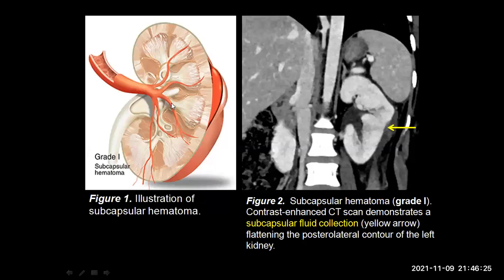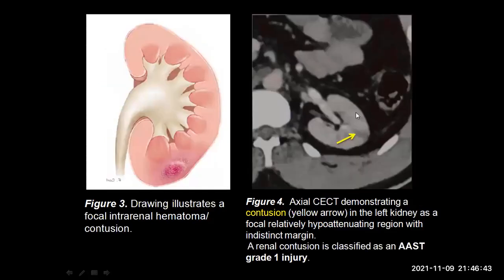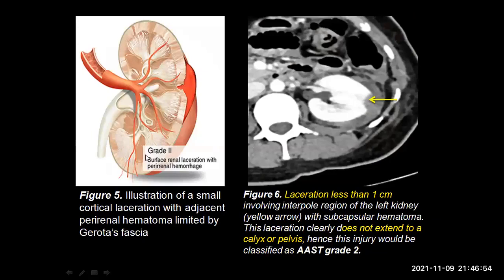These are a few reference cases. The first image is a coronal CECT image. You can see that a grade 1 injury includes either a subcapsular hematoma or a renal contusion. In this image, you can see there is subcapsular fluid collection that is flattening the posterolateral contour of the left kidney. This is again a grade 1 injury wherein you can see that there is a hypo-enhancing area in the interpole of the left kidney — this was a renal contusion. This case was a grade 2 injury; grade 2 injuries include renal lacerations that are small, that is less than 1 cm, and which do not extend into the collecting system. You can see that in the interpole region there is a small laceration and an associated subcapsular hematoma, and this laceration is not extending into the calyceal system.